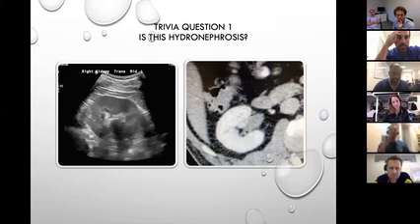Could that be a hypoechoic shadow, like an acoustic shadow secondary to some calcification? This one you're talking about, going down, isn't it? Yeah, that's your edge shadows coming in from the kidney. So kind of getting a little bit of a shadow there. I don't know what this is. Actually, the pelvis of the kidney, of the collecting system.